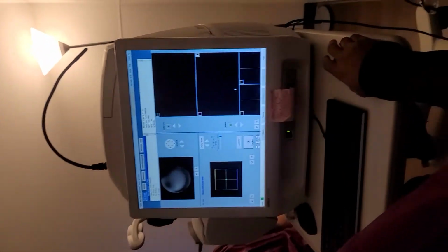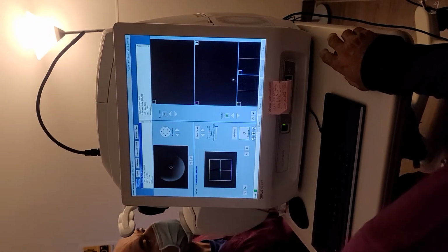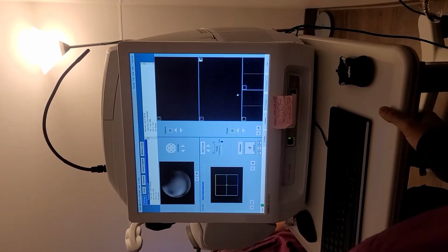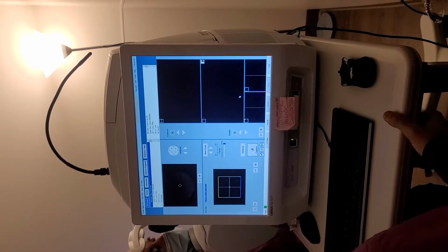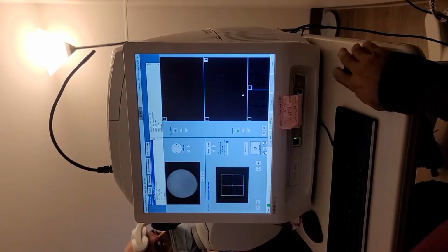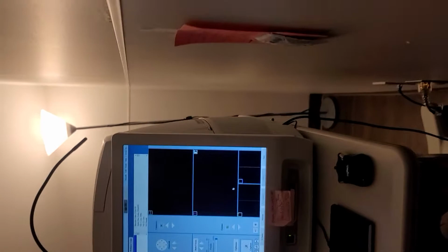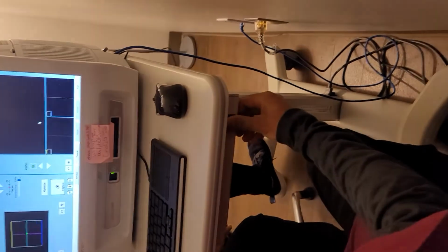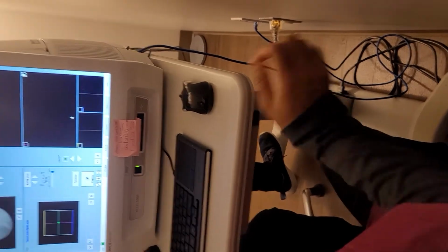Right? And you can always use the white and the blue. So the blue patient, put your chin on the blue line and head to the headrest. It's too high for me. Okay, now it's too high. Now use the machine to bring them down. Like that. More. Yeah, that's fine. Okay.